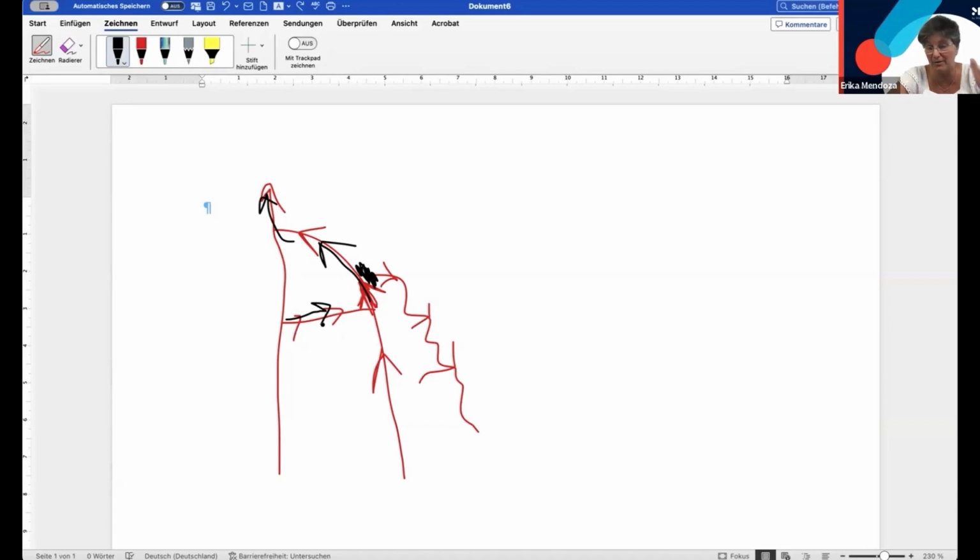And I can tell you from 27 years of experience, the perforating vein will still be refluxing. The blood will go upstairs and drain to the deep vein, and nobody will bother with it, except that eventually a new tributary will form. Closing tributaries is very difficult because you have to make a long scar. This tributary was tortuous. You can't go inside with a good probe. So I would just say he is asymptomatic. He needs no treatment. But I know this is not very good monetarily.